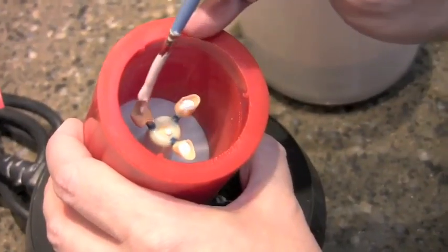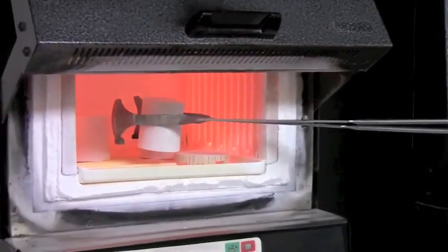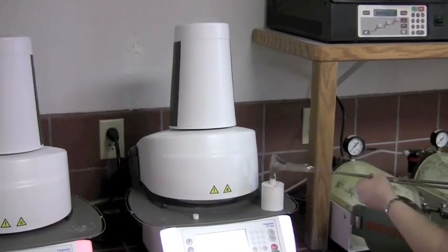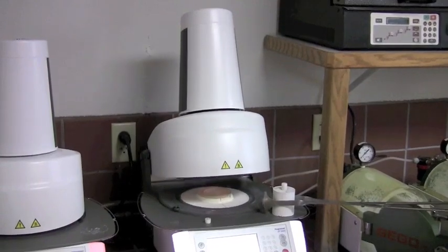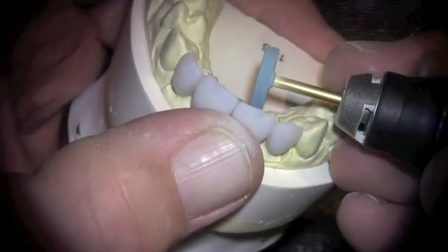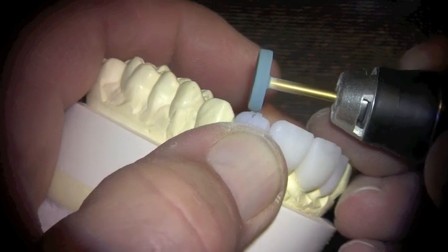From here we'll go ahead and sprue and invest in a traditional manner for pressed ceramics. Once we have everything invested, we'll go ahead and burn it out in the burnout oven. We'll use a fast burnout technique. Once the burnout's completed, we'll go ahead and put the desired ingot, in this case an opal 1 ingot, into the ring and put it in our Ivoclar pressing furnace. Once the pressing program is complete, we'll go ahead and devest the restorations, and we start grinding our sprues off.